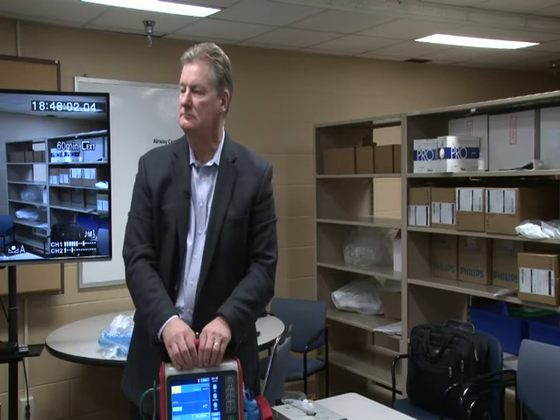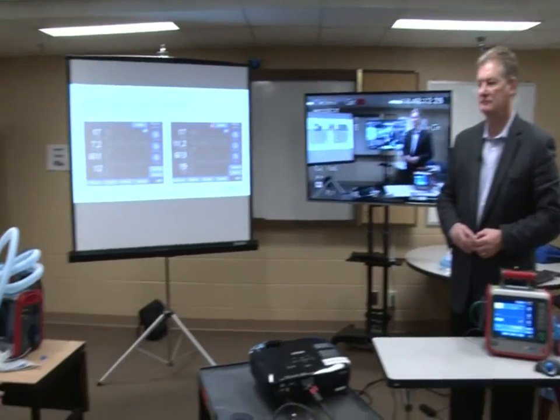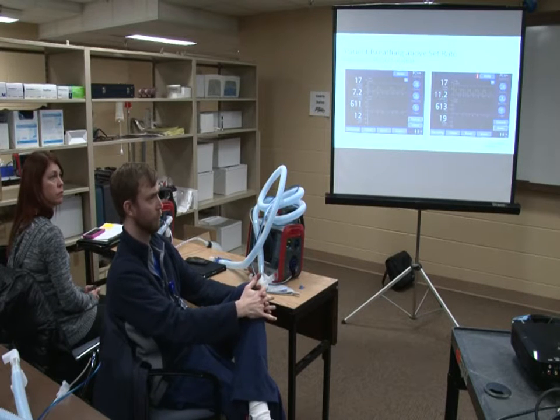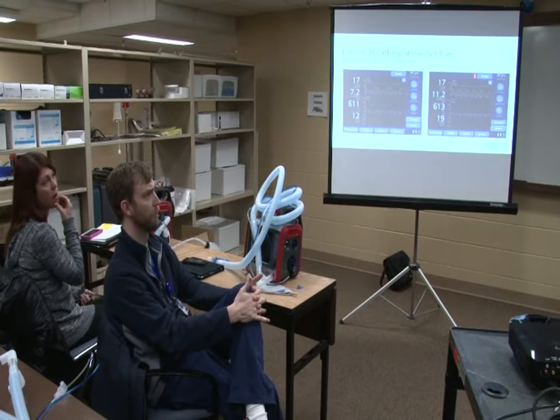One scenario, not really hypothetical, happened a year or so ago. We took a patient with a complicated pulmonary history. The pulmonologist wanted very specific settings for that patient, and we couldn't accomplish that with our transport ventilator. They actually sent their respiratory therapist with them. Will the ASV mode bridge that gap between facilities, or would we still rely on whatever that pulmonologist has?